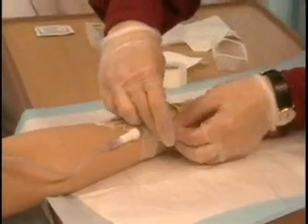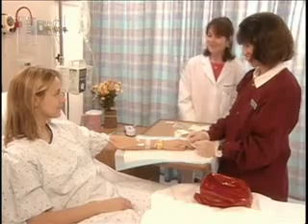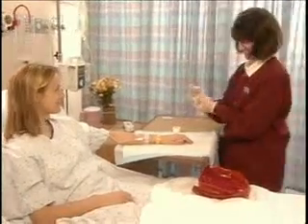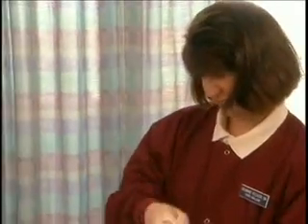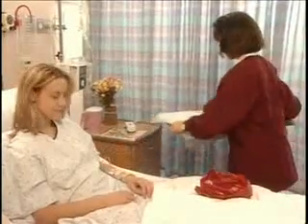Now I can open the clamp and turn on the pump. Does everything feel okay? Feels fine. Okay, just ring if you need anything. Thank you, Ms. Markowitz. Nice work, Jeannie. You did good.